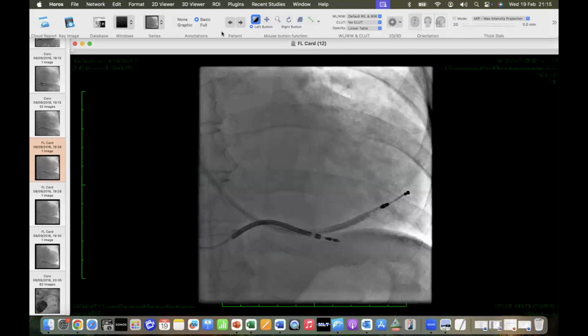What is the advantage of a single coil in a patient without obstructive airways disease and without severe obesity in the event that the patient's device becomes infected? We'll be discussing infected devices later. It's a little bit easier to remove a single coil lead than it is to remove a dual coil lead. But I take your point that there are many operators who would recommend a dual coil lead if the device is right-sided.